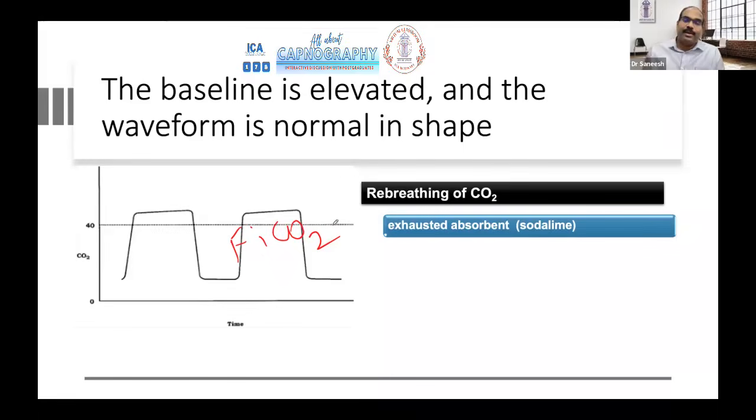And if all the exhaled carbon dioxide gets exhausted through the APL valve, then the role of soda lime is minimal. So that's not the point. Transiently, you try to increase the fresh gas flows and then see if a soda lime canister change is required.